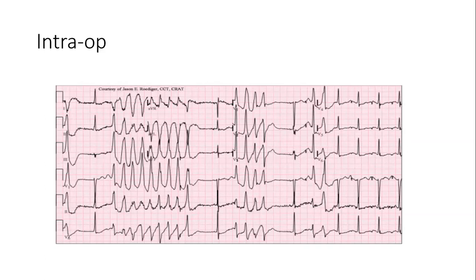But then again, let's go back to how to answer for the exam. What you've given me is totally all correct. But I remember especially now with the new method where you use the computer and stuff like that, try and use as minimal words as possible. So if they ask what is this, say it's a torsades, what's your management? It depends where the patient is.